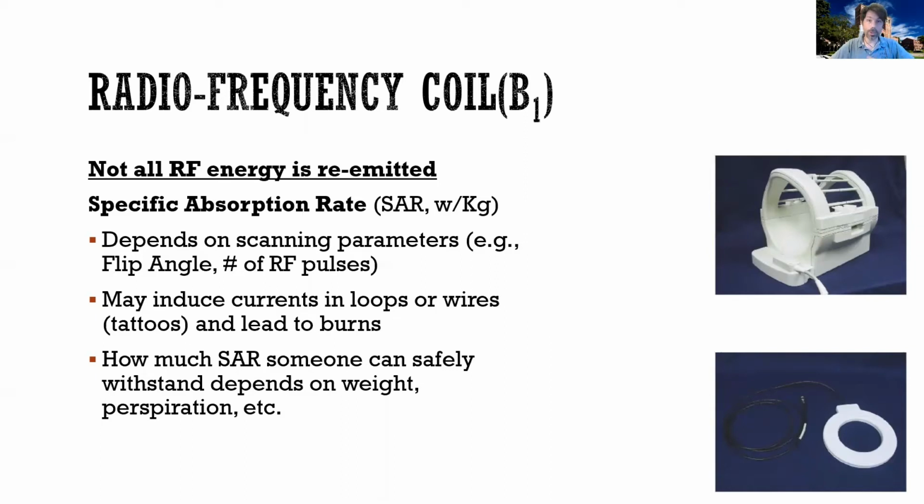In the case of our devices, which are focused on the head, if somebody has a tattoo on their waist, on their leg, not a big deal. If somebody has a tattoo on their face, then that is risky. If somebody has a tattoo on their shoulders and on their arms, there are different levels of risk. But if somebody has a tattoo, you want to think about whether you truly want to put them inside an MRI machine, particularly if you're doing the kind of fancy, advanced, interesting sequence that somebody in research would do, such as fMRI or other types of sequences, for example, to look at the structure of a brain with DTI, diffusion tensor imaging.